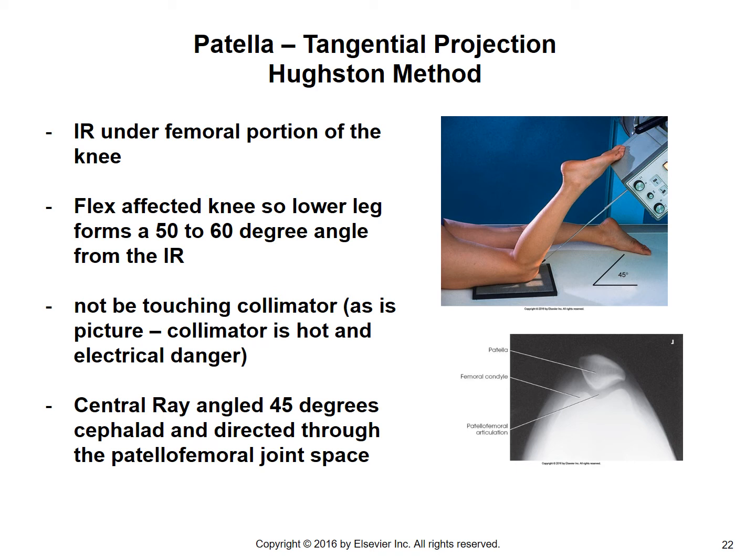Central ray is angled 45 degrees cephalad and directed through the patellofemoral joint space. There's the radiograph that you would get over on the right.